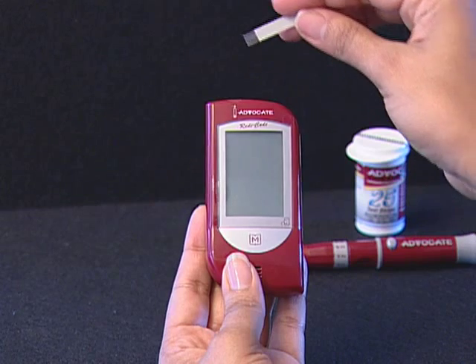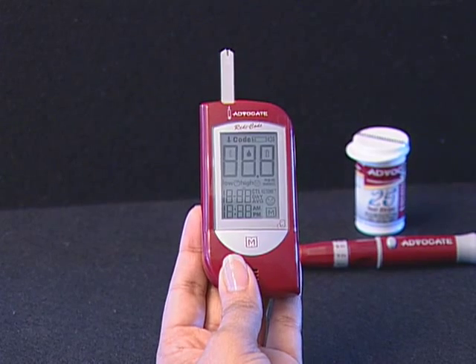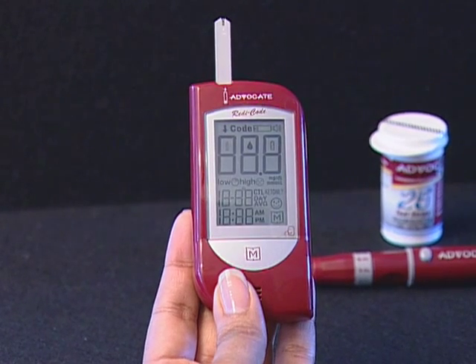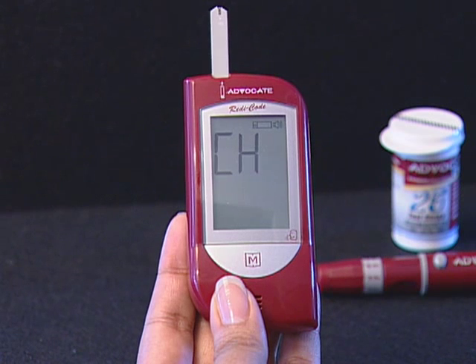Step 2: Insert a test strip with contact bars end first and facing up into the test slot. The meter turns on automatically and displays the following sequence: CH and the test strip icon, ambient temperature, date, time, and a small flashing black icon.